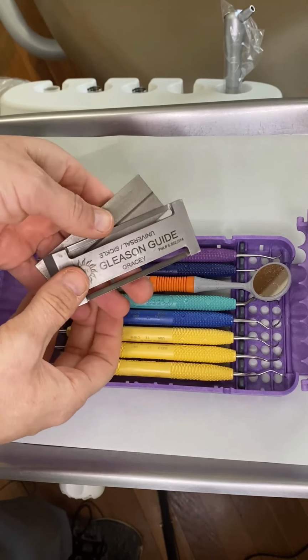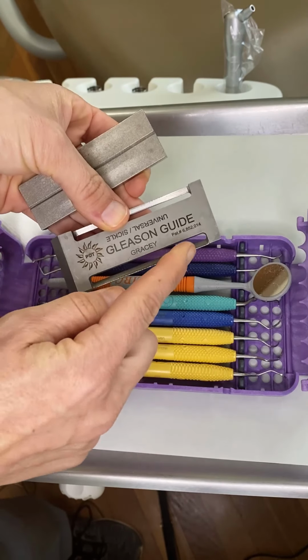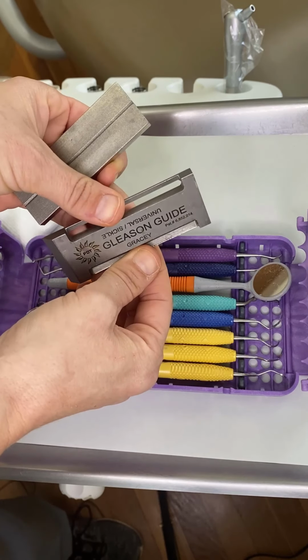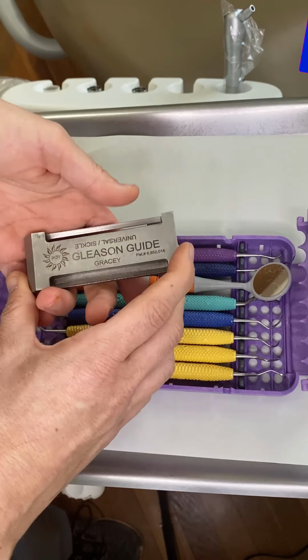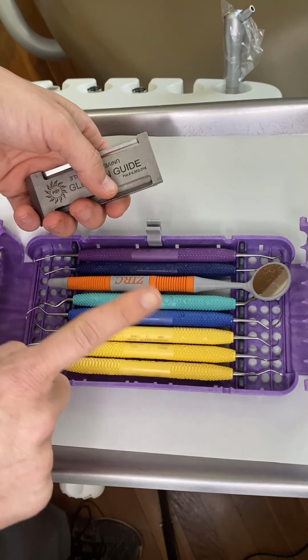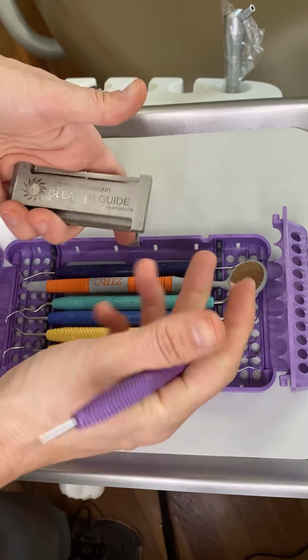Okay, so with the Gleason guide, you can use it on any kind of stone. On the Gleason guide, you have a Gracie side and a universal sickle side, and the ramps are just a little bit different. Even if mine might look a little different, because mine is old. I've literally had a Gleason guide since I graduated hygiene school. And so I'm going to go look at my instruments. I'll usually start with my anterior sickle.